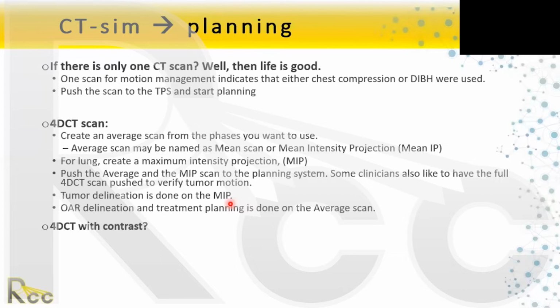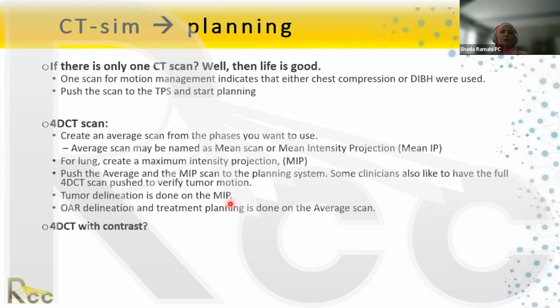Abdominal compression: is there a need for 4D CT, and can we use the contrast and do 2 phases? When we do abdominal compression, we don't do 4D CT except for one doctor. The idea is that abdominal compression restricts the diaphragm expansion, so the patient is breathing very shallow. So you do abdominal compression, inject the patient with contrast, and then do the CT scan. You only have one data set.